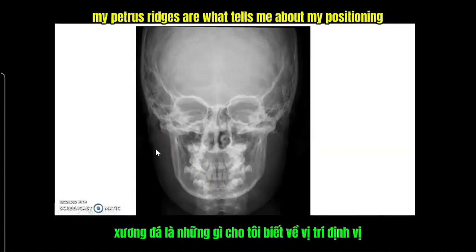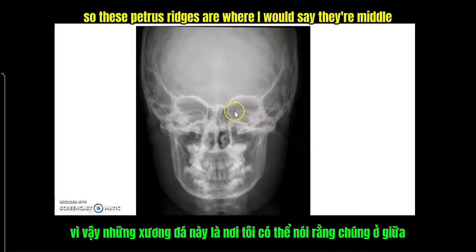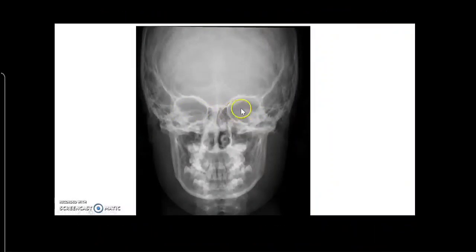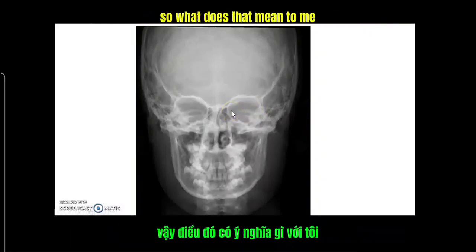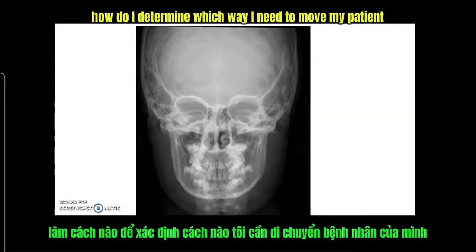And then what do I look at for positioning for head work? My petrous ridges. My petrous ridges are what tells me about my positioning. So these petrous ridges are where? I would say they're middle, maybe a little over midline of your orbit, right? So what does that mean to me? How do I determine which way I need to move my patient?